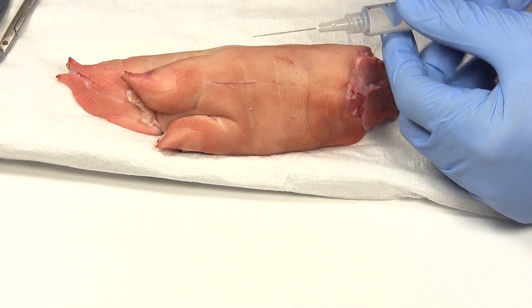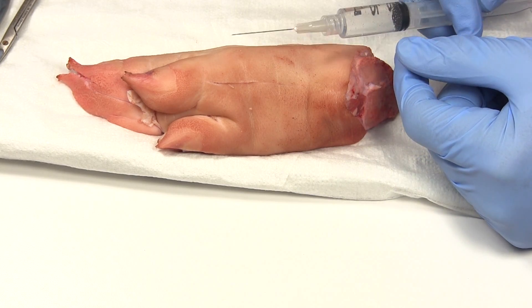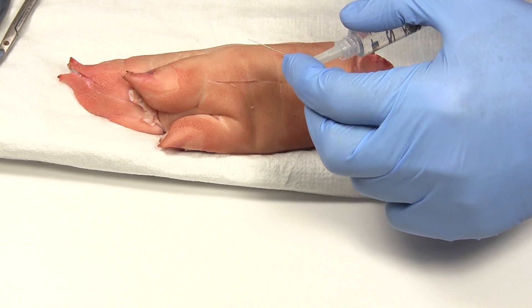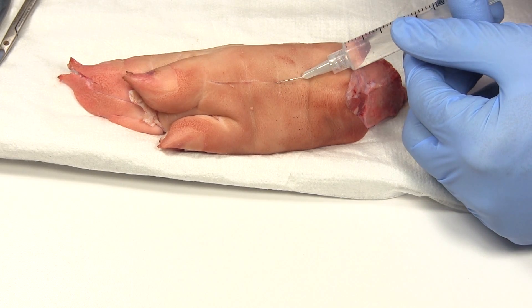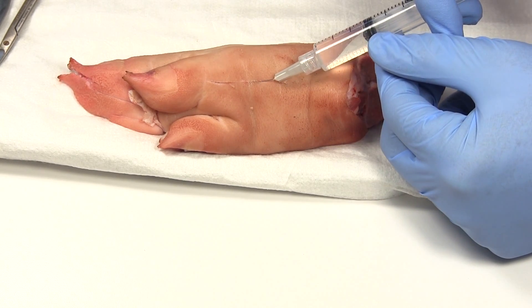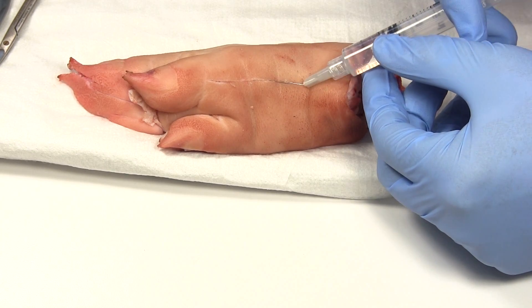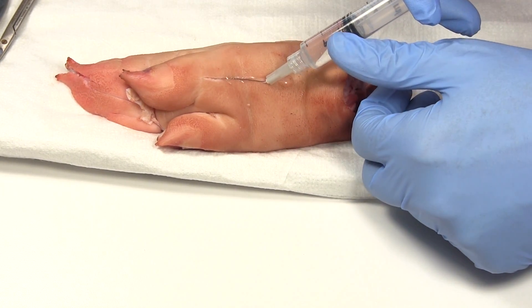That's not effective and it's going to cause a lot more pain to the patient. You want to go from the inside of the wound. As much as this scares patients — 'oh my god, you're going inside the cut' — it's actually about half as painful, according to the studies. By bending the needle slightly, you can get on the inside and run it along the laceration, injecting as you go. It causes a lot less discomfort to the patient and is a lot easier on you.